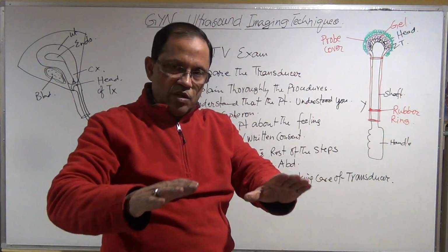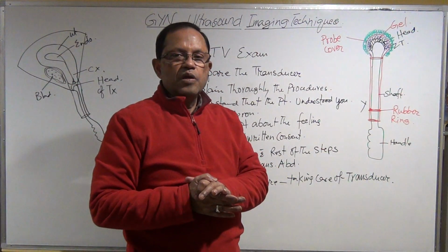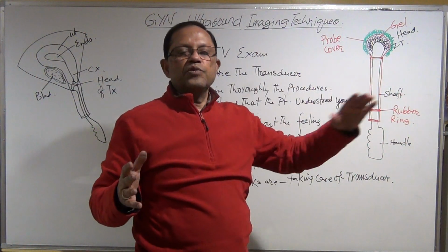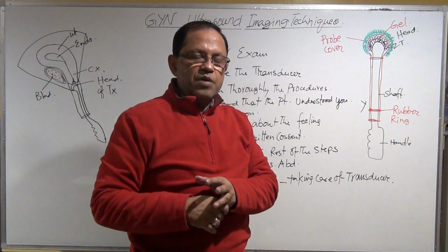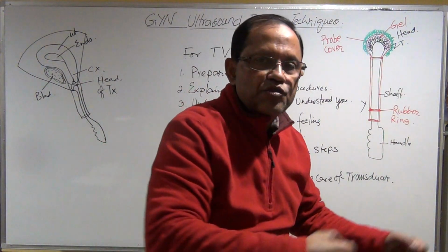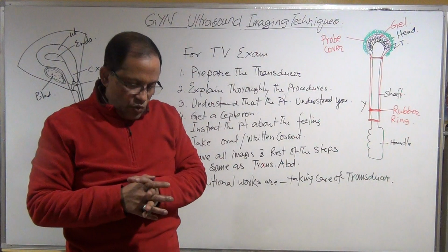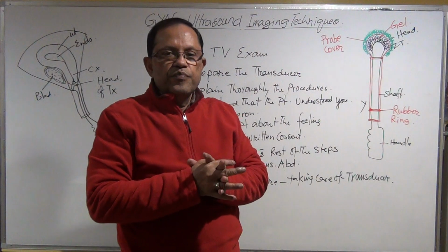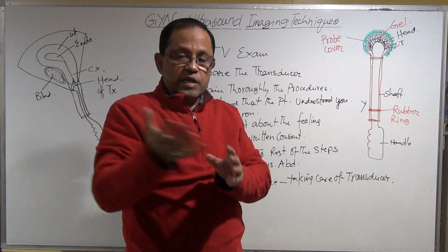Okay? Let the patient stay on the bed, but give her a towel or cleaning supplies. Or if the patient is able to walk, you can say, okay, you can go to the bathroom and take care of yourself. In the meantime, what are you going to do? You will take the transducer into the cleaning room. Then you will clean the transducer with tissue paper. Then rinse with water.